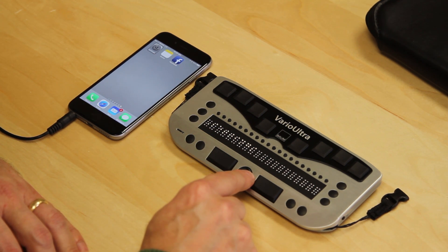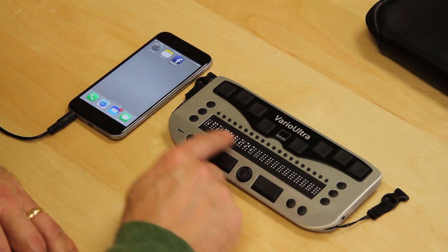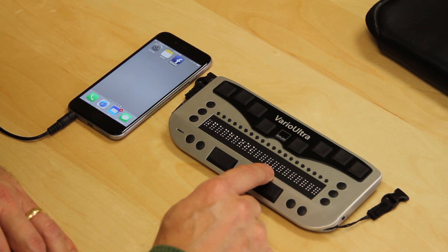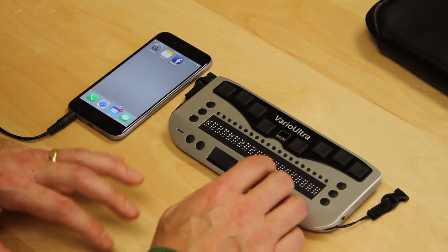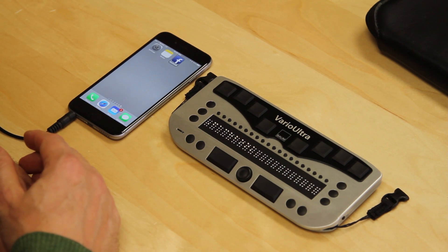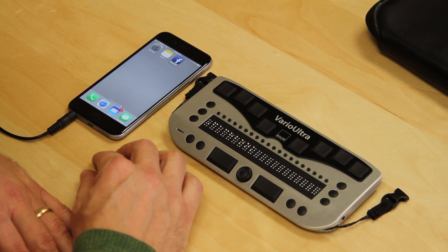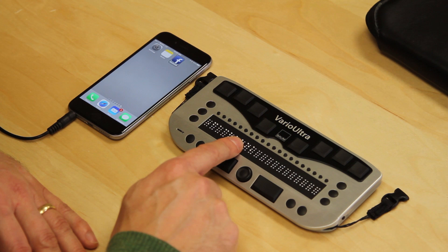If I use the NaviStick to the right, it says notes, then double tap to open. If I go right again, it says Facebook. Every message we hear through VoiceOver, such as double tap to open, is also displayed on the Braille display of the Vario Ultra. At this point, I could be typing on the Vario Ultra and making text come up on the phone, or using the Vario Ultra to read books, emails, or other information on the phone. Everything spoken by VoiceOver will be displayed in Braille.